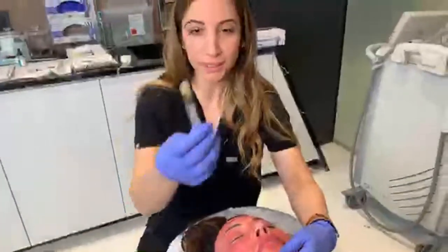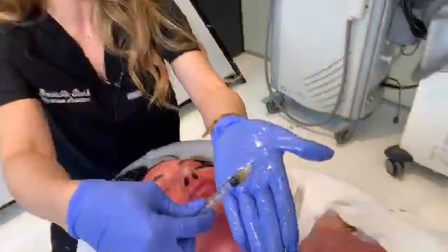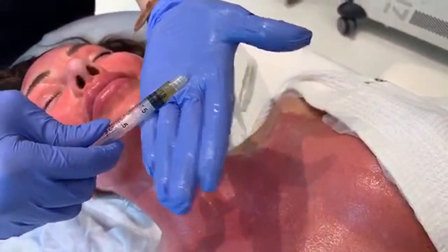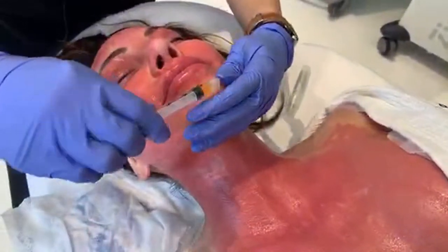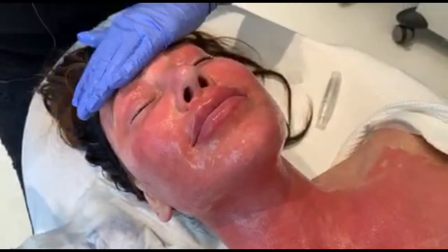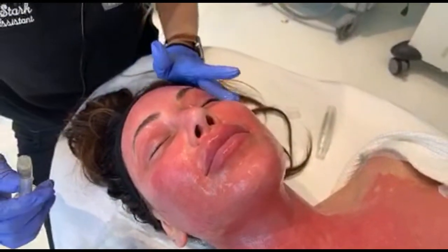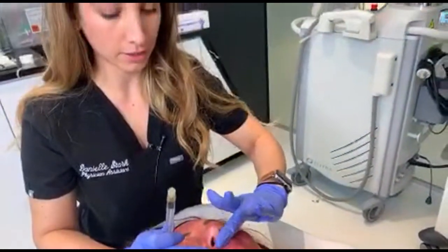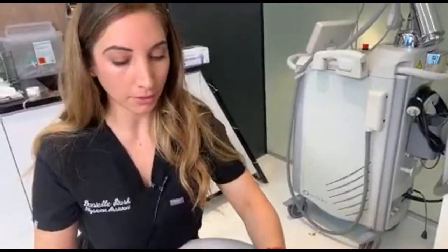The way we get PRP, the way we get our little golden serum here, we draw blood, centrifuge it, so we spin it very quickly until all the particles that are heavy sit to the bottom. The liquids all rise to the top, just like oil and water, and then we take that yellow serum and we use it for healing. So this concentrates about 90% of your growth factors, increases your healing by about 40%.